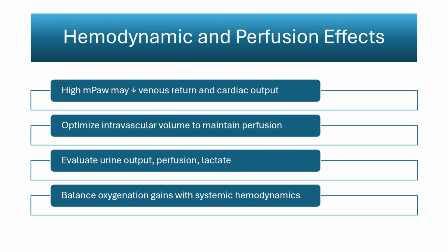In infants with persistent pulmonary hypertension, maintaining steady oxygenation and avoiding abrupt swings in intrathoracic pressure reduces pulmonary vascular reactivity. A stable mean airway pressure enhances the effect of pulmonary vasodilators by distributing them evenly across recruited alveoli. Excess pressure, however, can worsen right ventricular afterload and impede pulmonary blood flow, emphasizing the need for fine pressure control rather than aggressive recruitment.